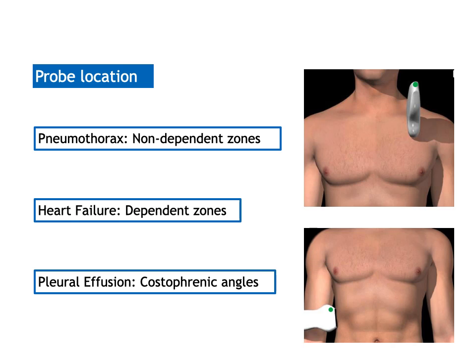And if I am looking for pleural effusion, my aim will be putting the probe, like in this picture, in the mid-axillary line with the indicator to the head, and we could expect, because we are scanning for deeper structures, that this probe is the curvilinear probe or the cardiac probe. So it's a low frequency transducer.